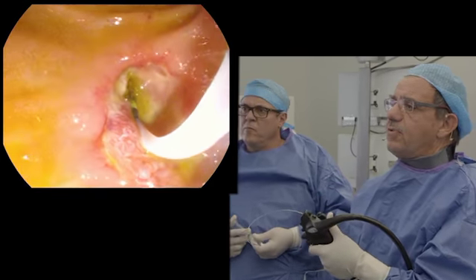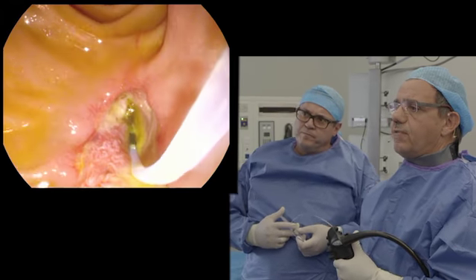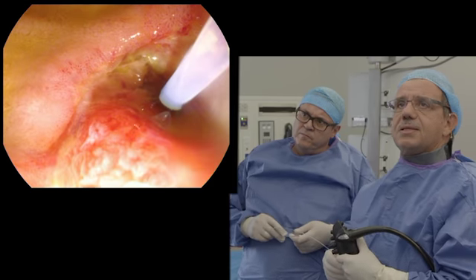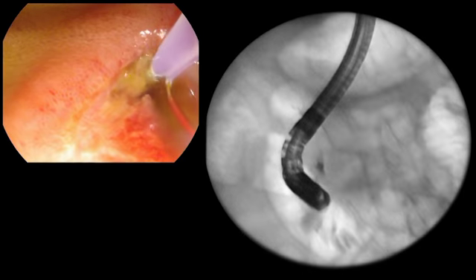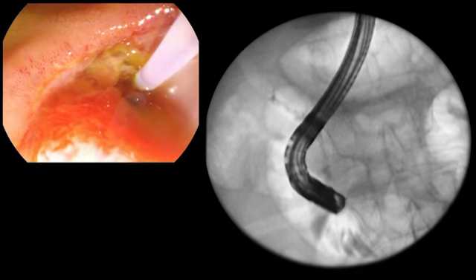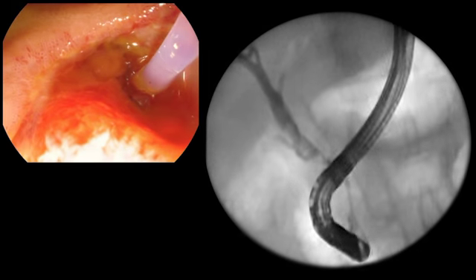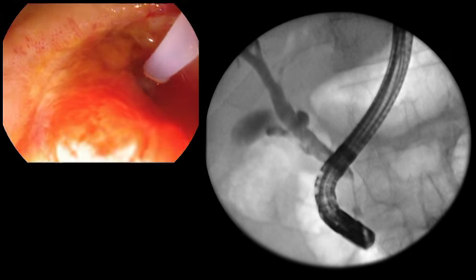It's not easy. Even with the sphincterotomy, you see that you have probably infiltration of the bile duct by the tumor. You can inject. X-ray, please. Nothing happened. Stop. Okay, now we have a deep cannulation of the bile duct. You can inject, please, to obtain a cholangiogram. Inject. And you see that the stenosis is a long stenosis.